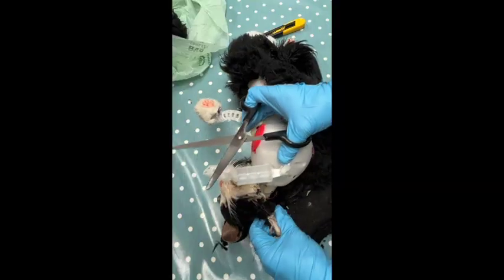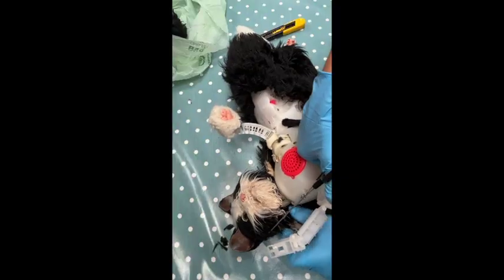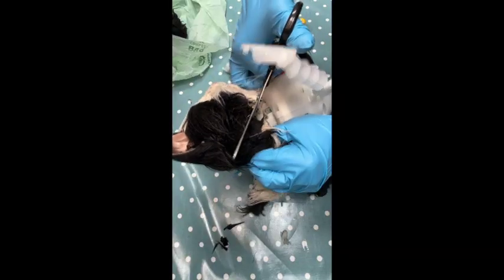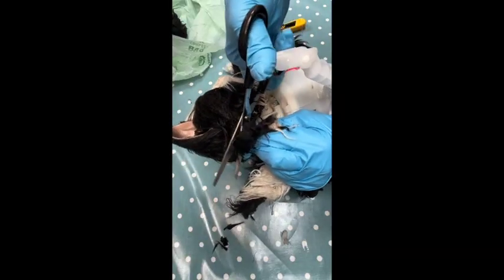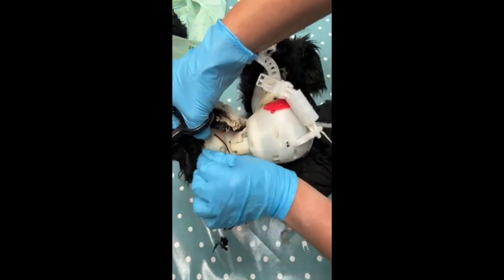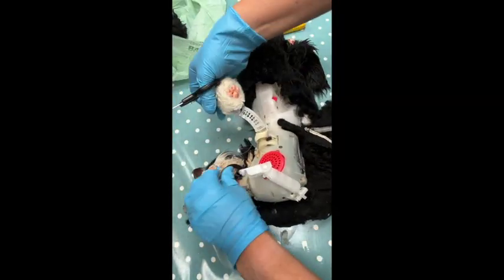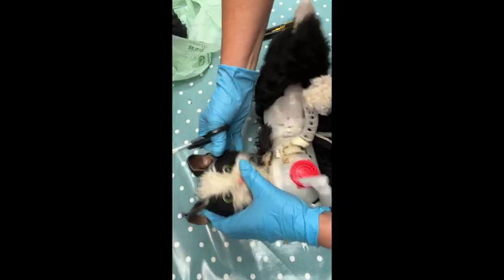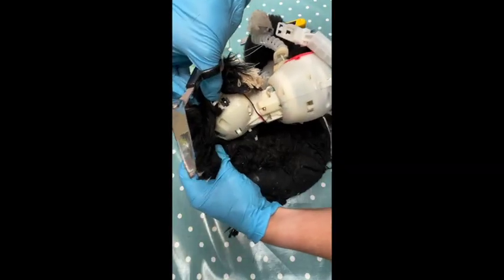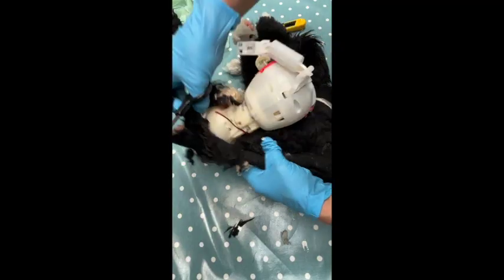Right, oh, right, head is definitely smellier. Okay. Right, cat, you're about to lose your face. Right. Okay, oh, look, a little bit of elastic. So you can ping the elastic off. I wonder if it's the same on the other side. There's another sensor on top. Not sure where that came from.